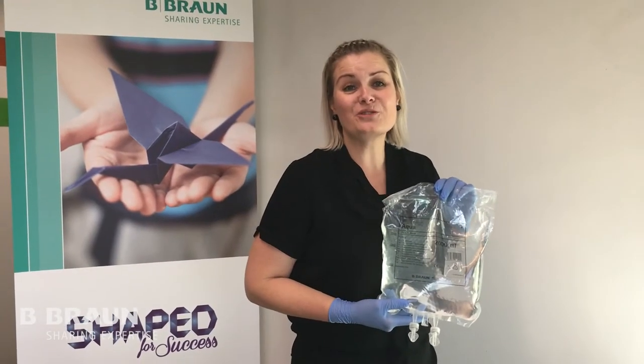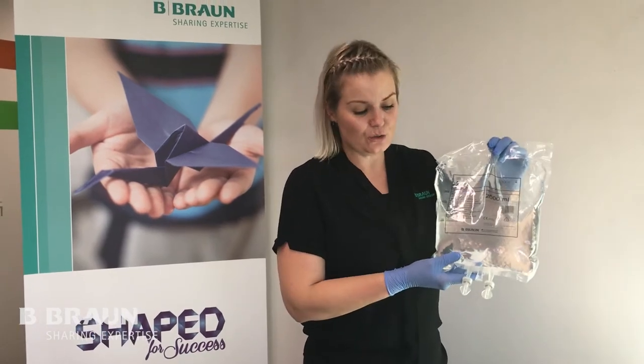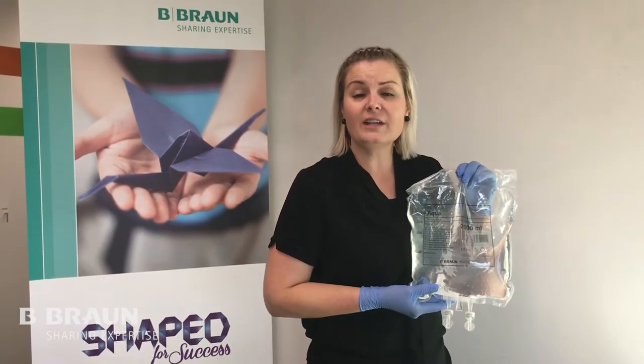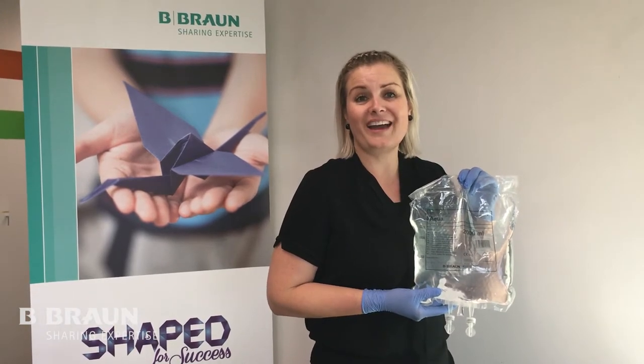I'm going to take you through the B. Braun Eco Bag. Here are two grey ports that are both sterile and resealable. I will now take you through how to spike the bag.